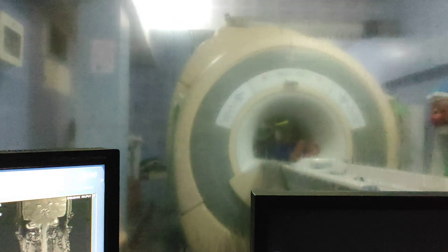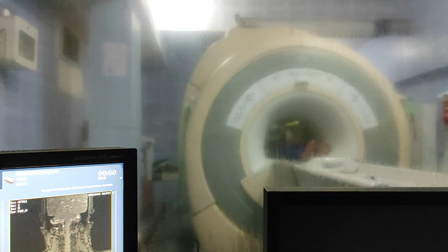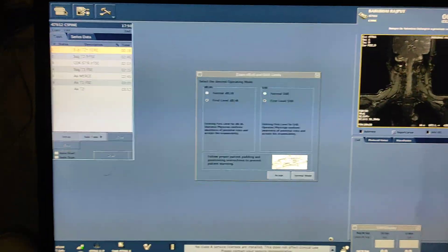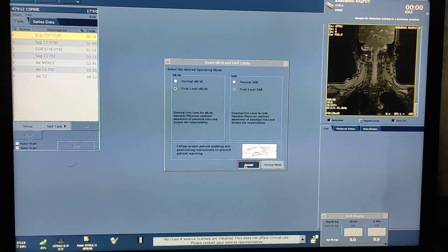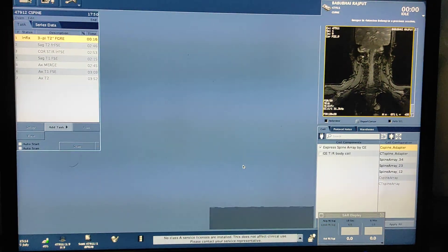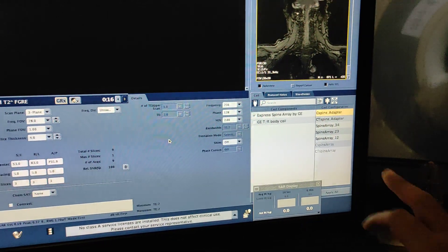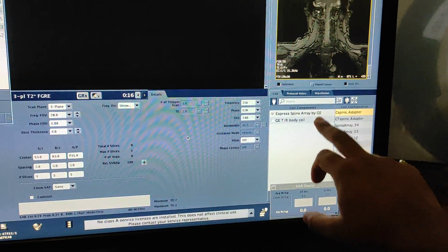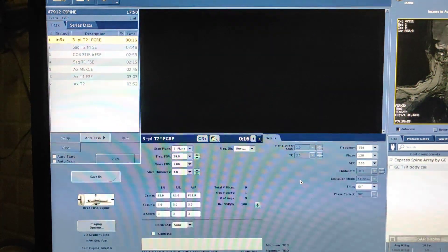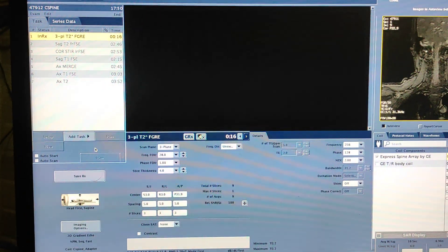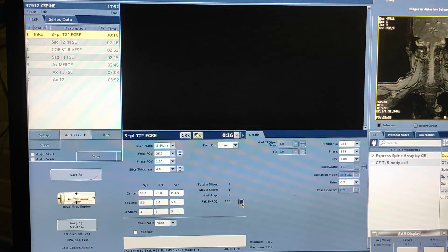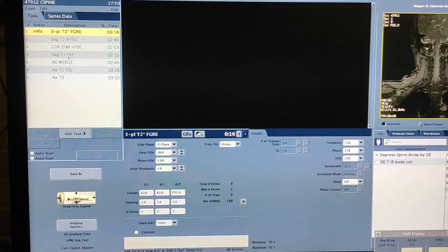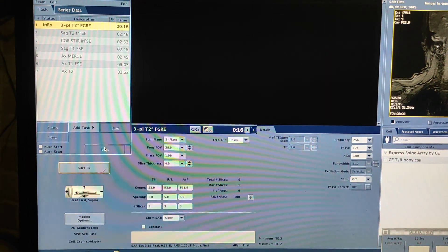Start exam. Patient position is head first; coil is cervical adapter. First of all we are taking the three-plane localizer. The coil is the C-spine adapter coil — your coil is connected over here. Without the three-plane localizer you can't do anything, so first of all you have to take the three-plane localizer and save RX.